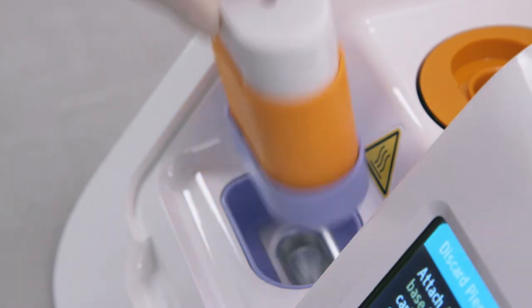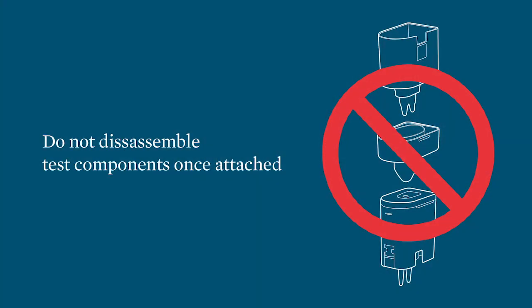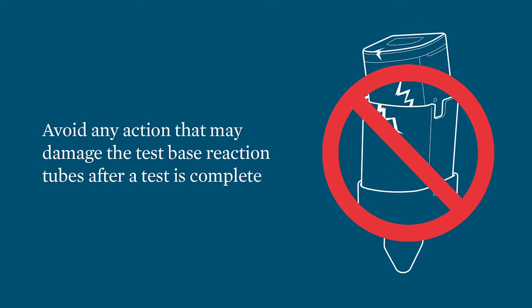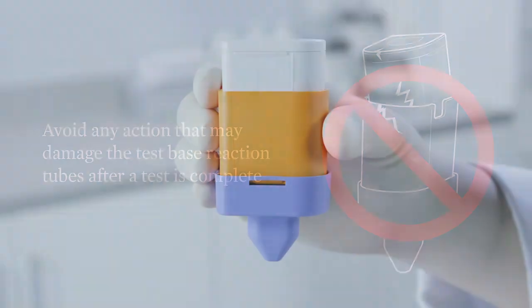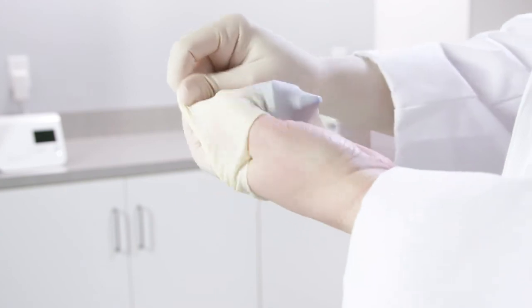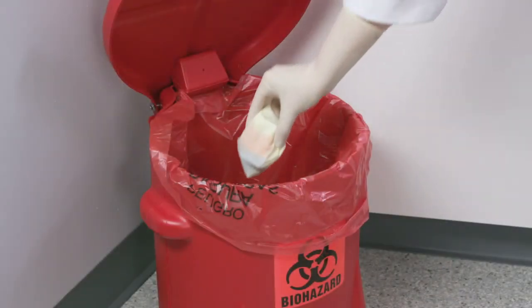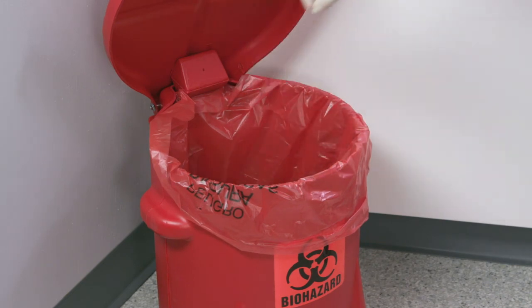Once all the pieces are connected, remove the test unit from the instrument and dispose of it according to federal, state, and local regulations. Do not disassemble test components once they are attached. Avoid any action that may damage the test base reaction tubes after a test is complete. It is advisable to wrap the assembled test unit into your glove, which provides an added barrier to avoid amplicon contamination. Make certain that placing the test components in the hazardous waste container does not separate the test components. You must avoid damage even after disposal. Never step on the unit or forcefully compact the waste container.